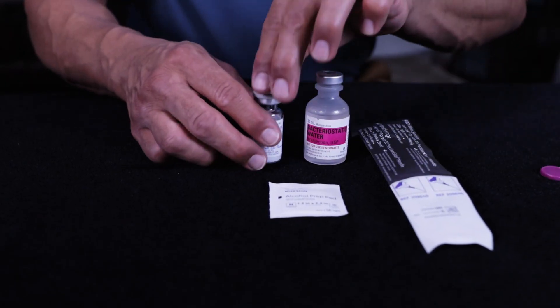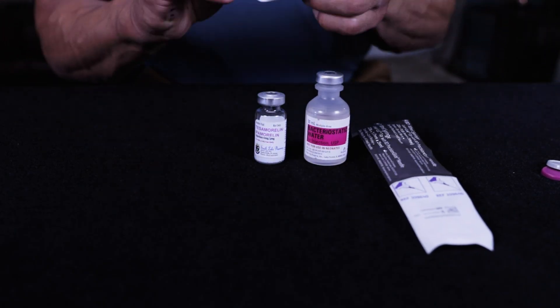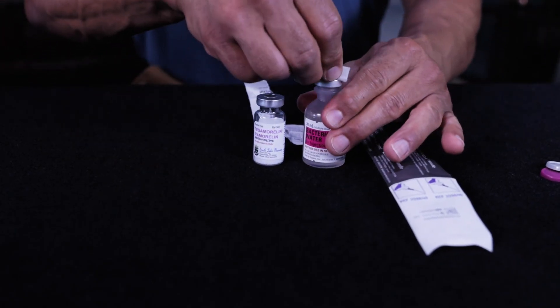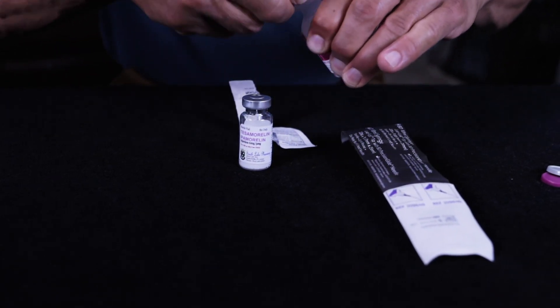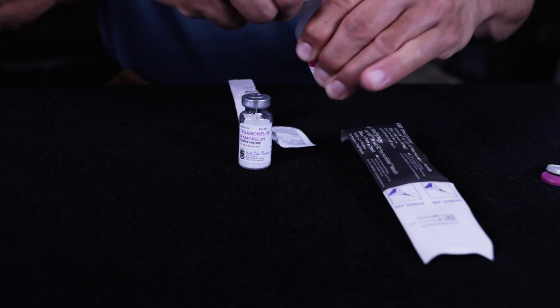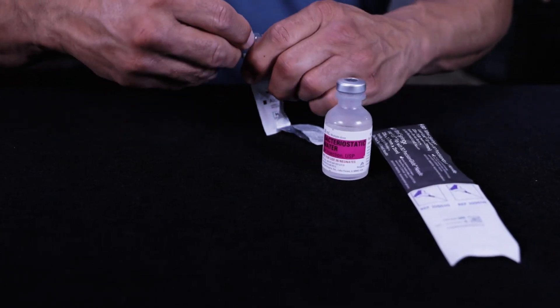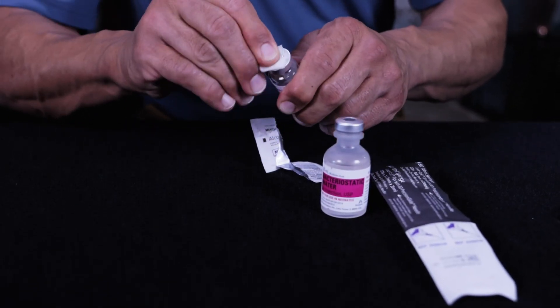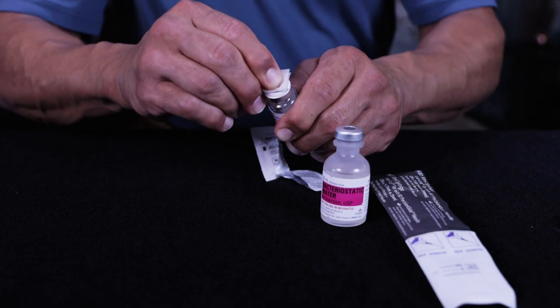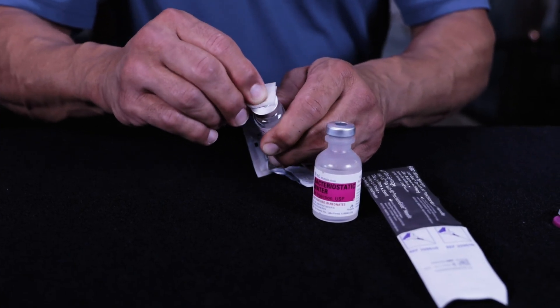Go ahead and remove the caps off the vials, get a fresh alcohol swab, and vigorously clean where you're going to put your needle — both of them. Don't be afraid, just get in there vigorously and clean that out. The last thing you want is an infection. You'll regret it.